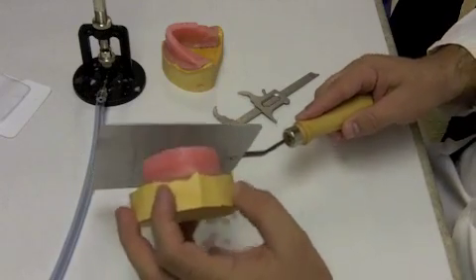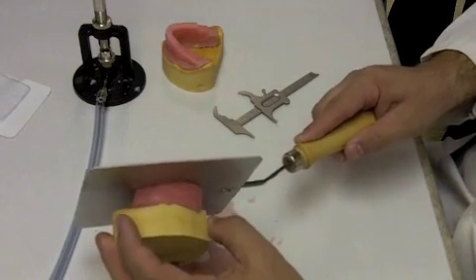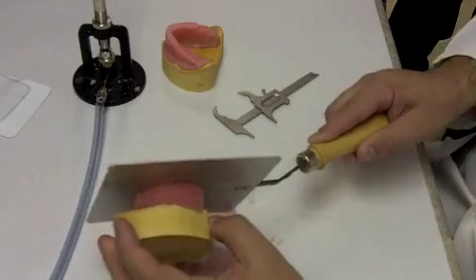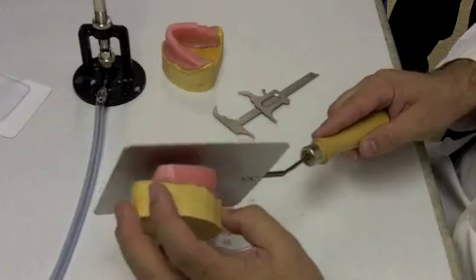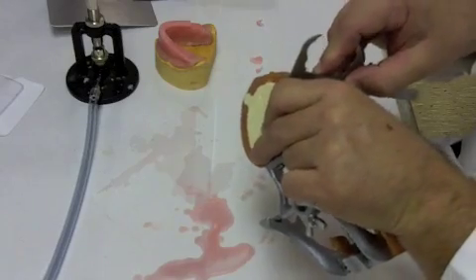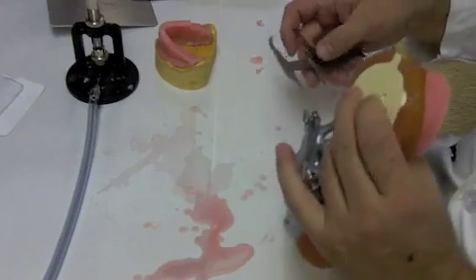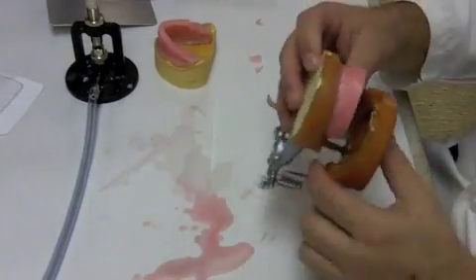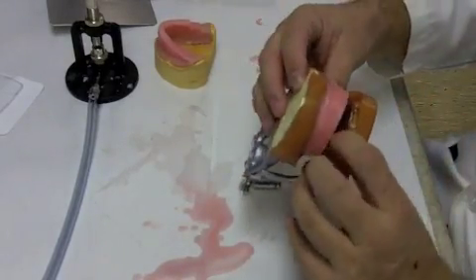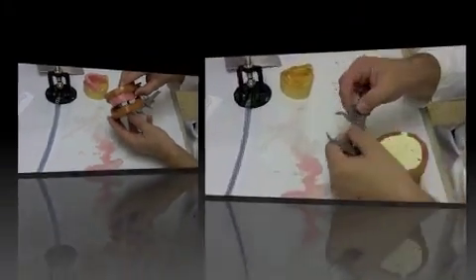Remember that when you use the Boley gauge, it makes the shortest line when it makes its little mark, so you want to make sure you completely eliminate that. Then you can come back in with your Boley gauge, and sometimes, if the wax is cool enough, or warm enough, you can actually use the Boley gauge to carve the last little bit. So now we have our 32 millimeters, and it's going to give us a nice occlusal plane. The occlusal plane is headed to approximately two-thirds up the retromolar pad.